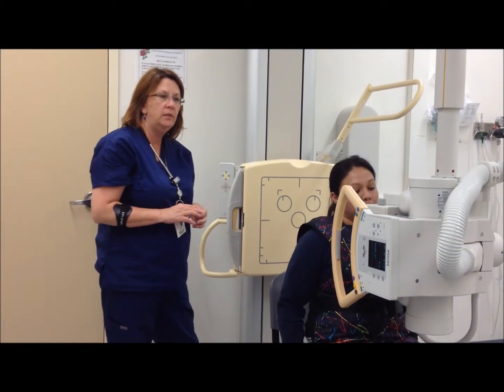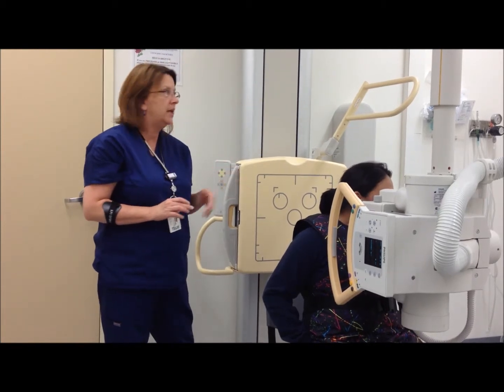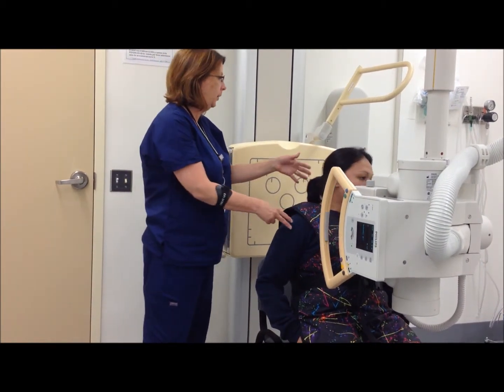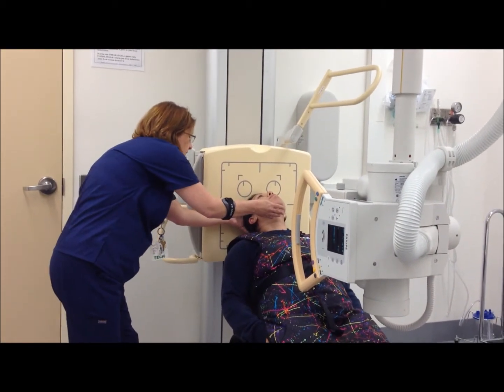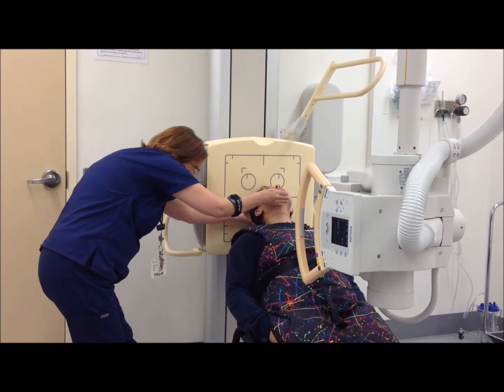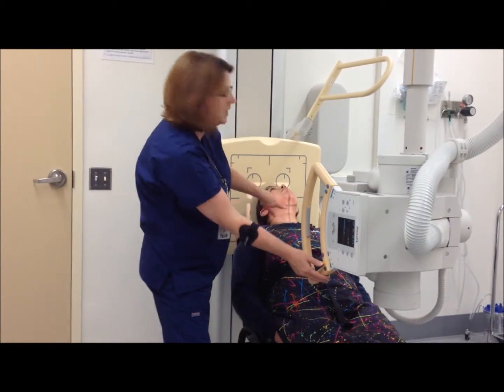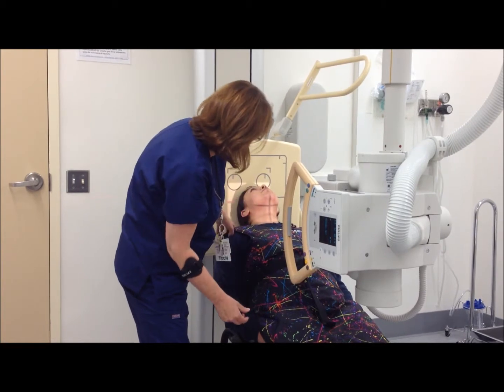Okay, for my final mandible series x-ray, I'm going to be doing an SMV, also on an 8x10 cassette. Patient is seated in front of the IR with her back facing it. She'll lean back, put the vertex of her head on the IR. Mid-sagittal plane perpendicular, her IOML parallel. My CR will enter halfway between the mandibular angles and mid-sagittal plane.